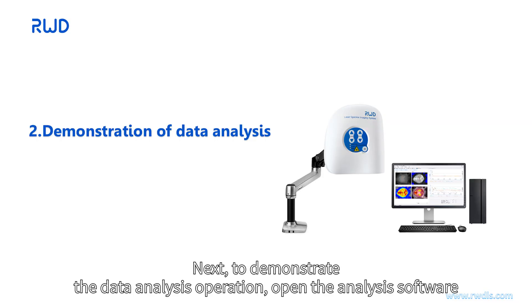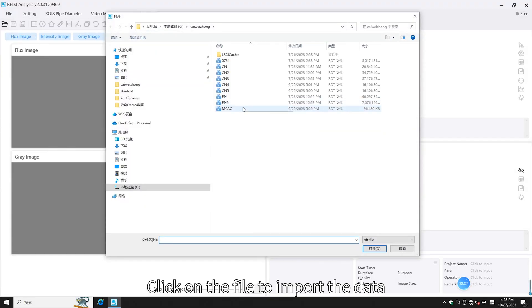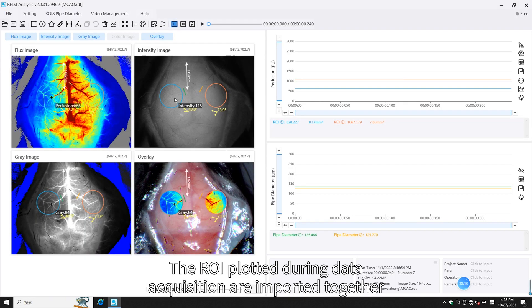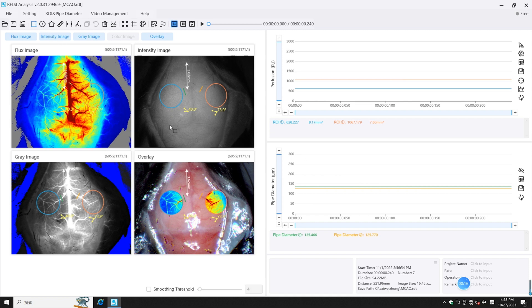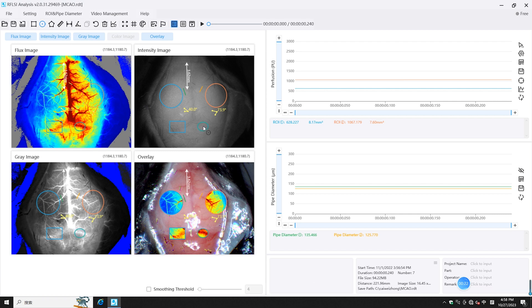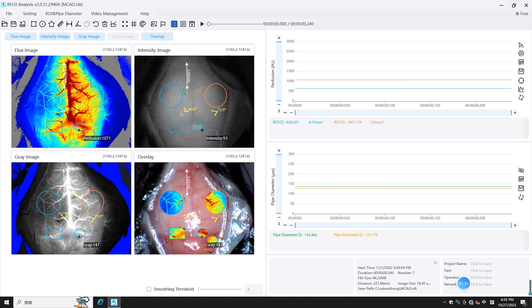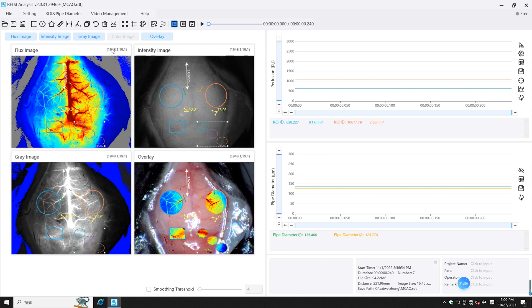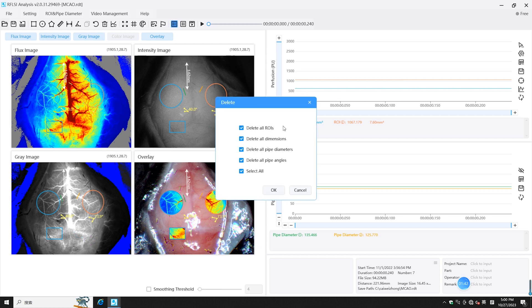Next, to demonstrate the data analysis operation: open the desktop analysis software and click on File to import the data. The ROIs plotted during data acquisition are imported together, and the curve graphs are displayed on the right side. You can draw new ROIs, vessel diameters, and vessel angles. You can also copy, delete, undo, export, or import the ROIs.